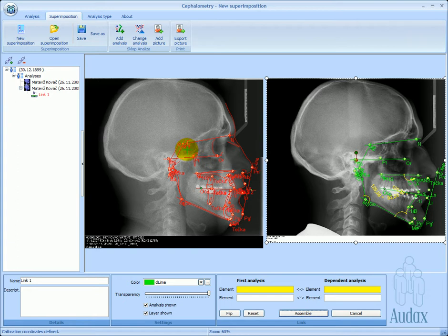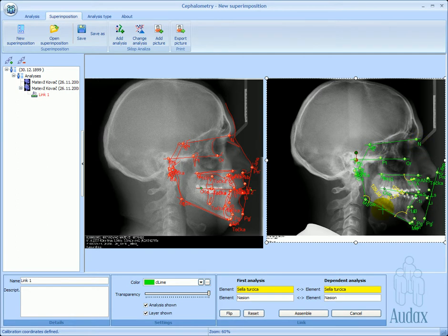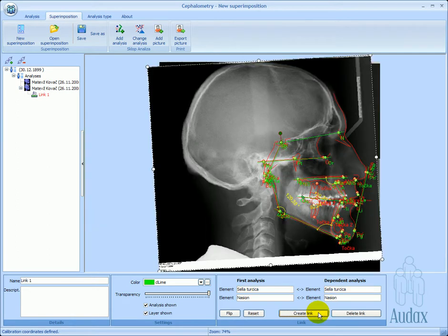Our first link is between S and N landmarks of the first analysis and S and N landmarks of the second one. We create the link and rename it SN.